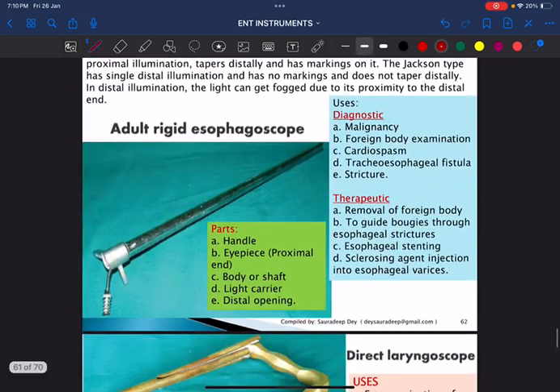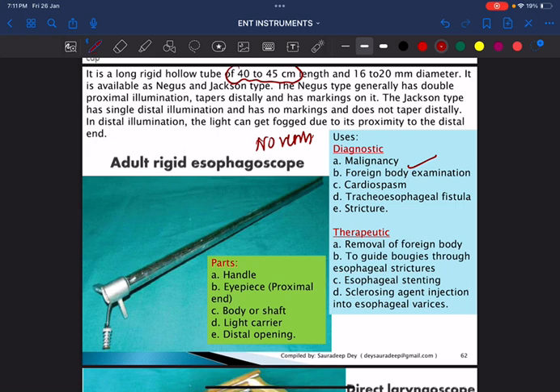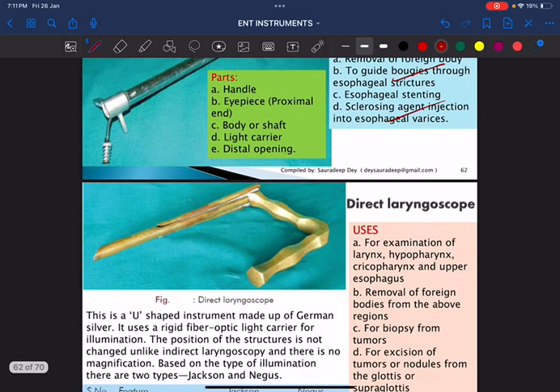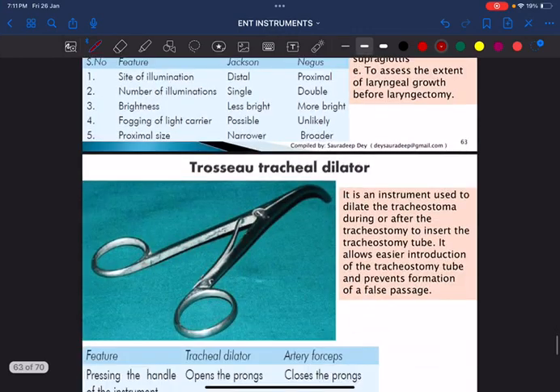This is the esophagoscope. There is no vent, and it is also 40 to 45 centimeters in length. It is used diagnostically for foreign body examination and in cases of tracheoesophageal fistula, and therapeutically for foreign body removal, esophageal stenting, or introduction of sclerosing agents in treatment of esophageal varices.